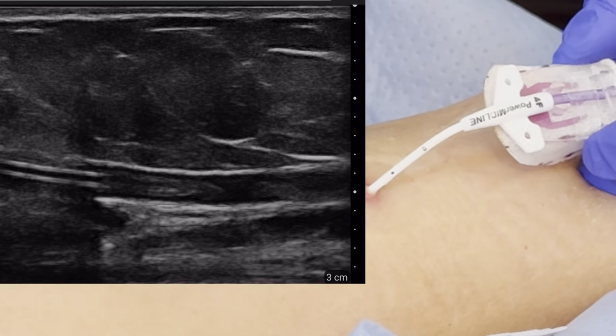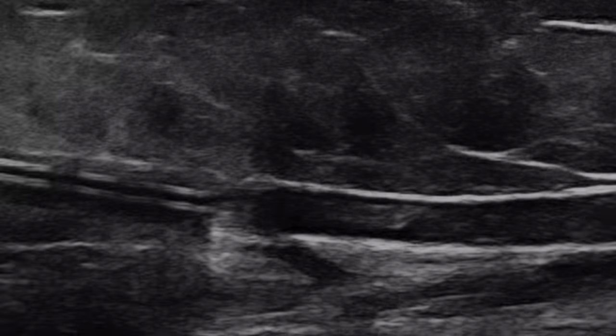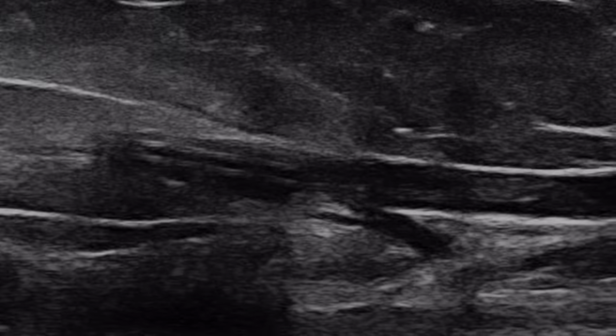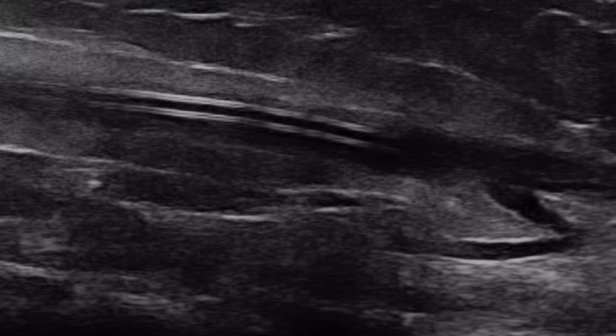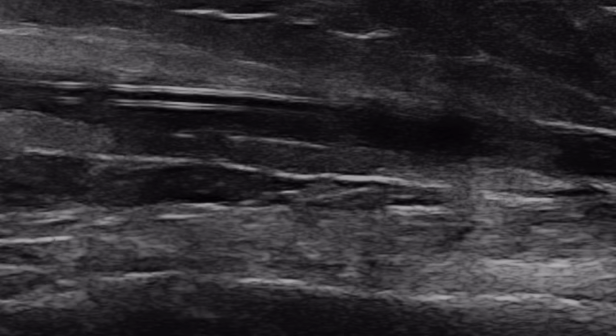It looks like at a valve — it's getting caught at the valves. Wherever there's a valve, it's going to catch and hold on to that clot. What's challenging about linear probes is that the ultrasound beam is a straight line, so any curvature of the veins will cause us to lose visualization in the long view. That's why this technique is quite difficult — however, if you can do it, I highly recommend you practice. I don't see any remnants of a fibrin tail here during this removal. It looks like it's just passing through the venous tissue.